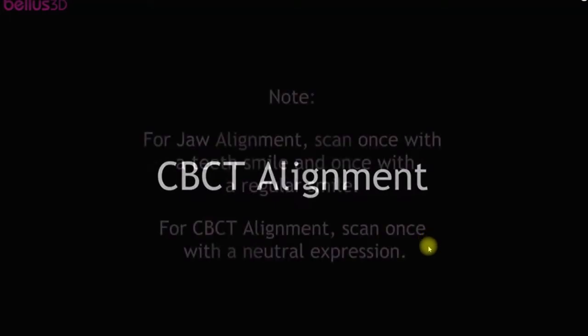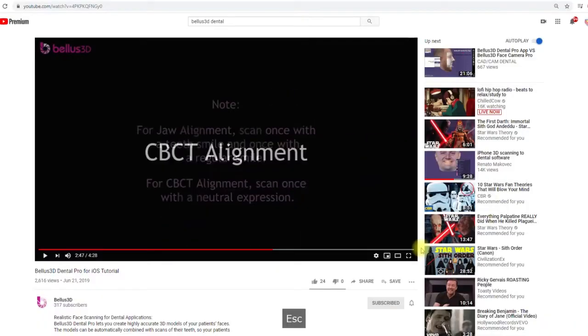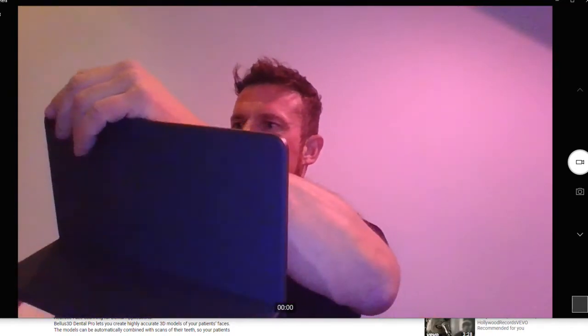Don't worry about that. So I'm going to escape here, and we're going to go to the camera and do the actual scan now. I'll show you how to line that up. Where's my camera? Okay. So here's the iPad. This might not be super clear.